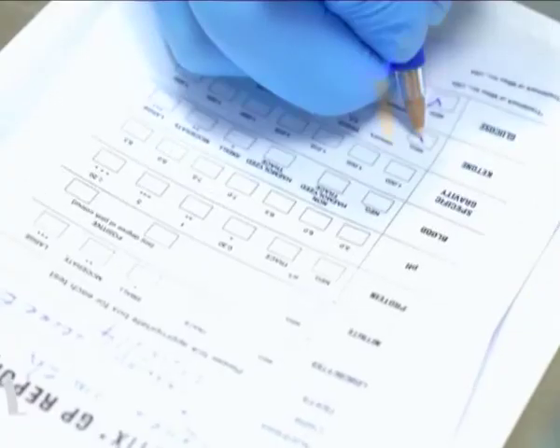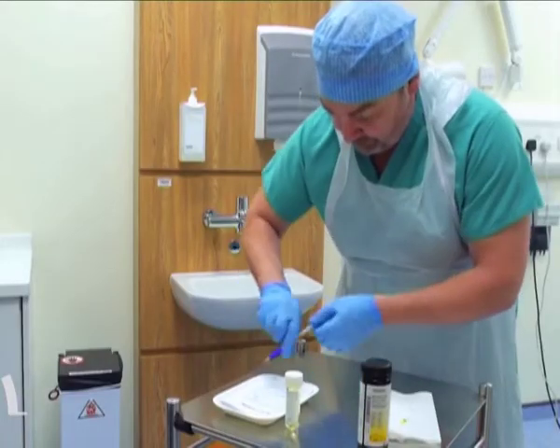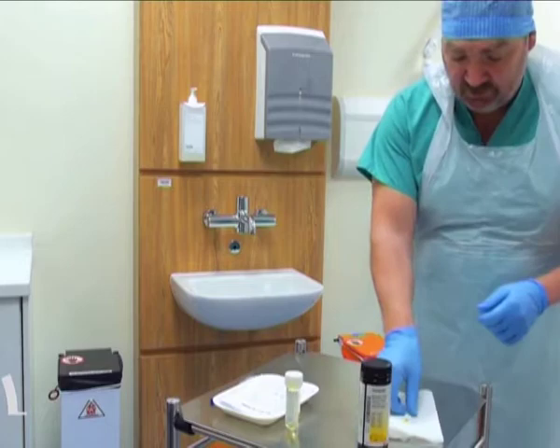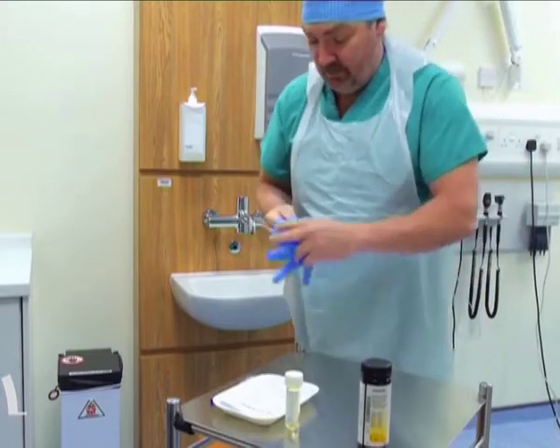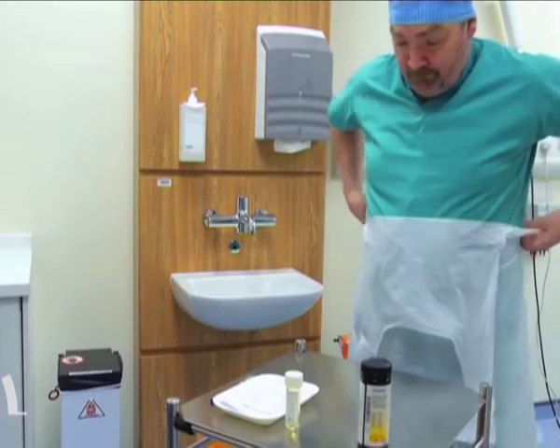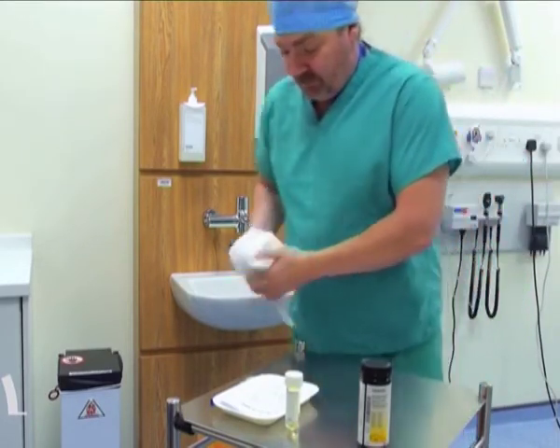The chemical examination is often done in conjunction with, or may be followed by, a microscopic examination of the urine if there are any abnormal results. Results from both sets of tests are then considered together for interpretation. Abnormal findings may be followed by additional urine and/or blood tests.